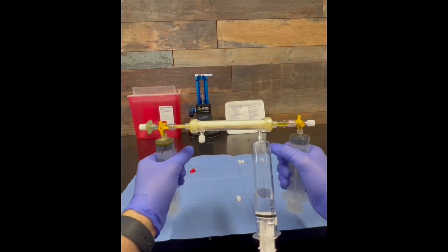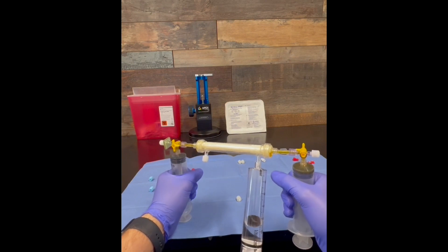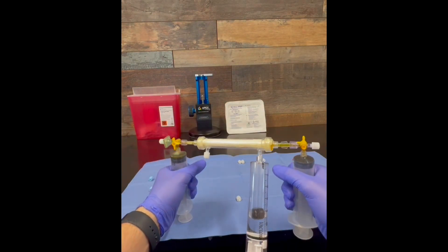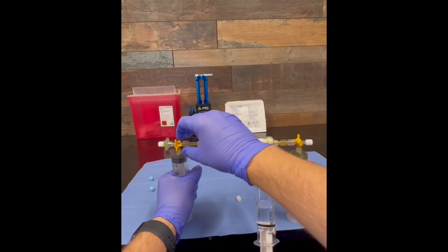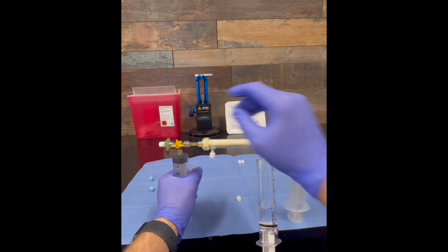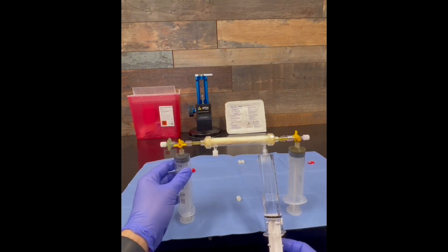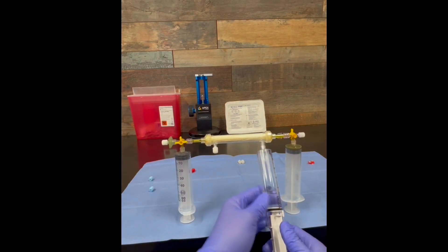Once you have no remaining platelet-poor plasma in either 60 ml syringe, push down on the plunger of the syringe attached to the side with the small green filter and orient the three-way stopcock as shown.